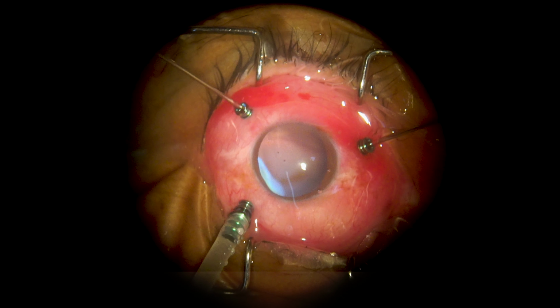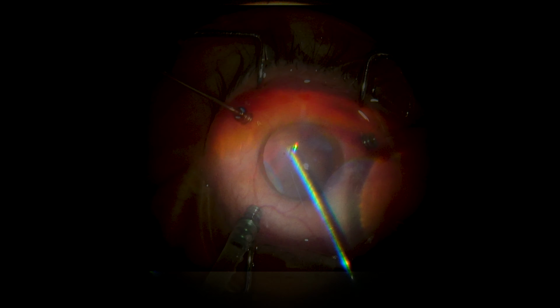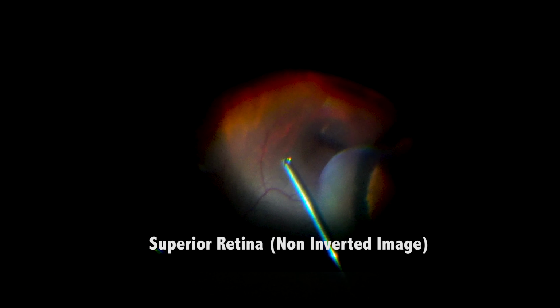You have superior sclerotomies and an inferior temporal infusion line. The image is non-inverted, as you see the cutter and light pipe coming upside down. The lens was moving in the mid-vitreous, and we had to be extra careful with the cutter not to misdirect it with the cutter contact. You could actually see some RPE rarefaction due to lens contact to the retina below.